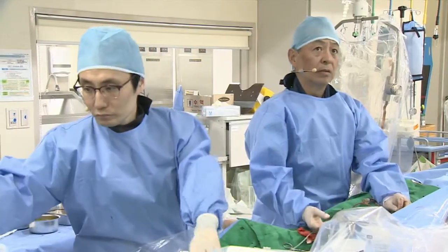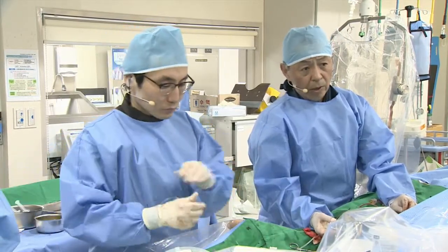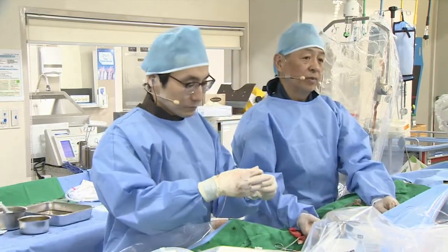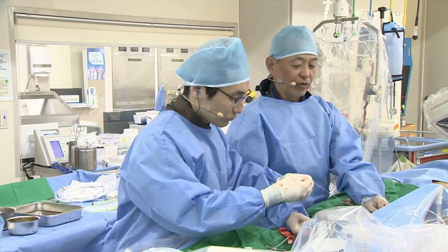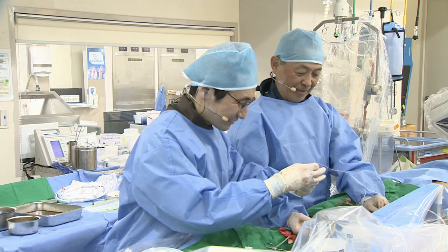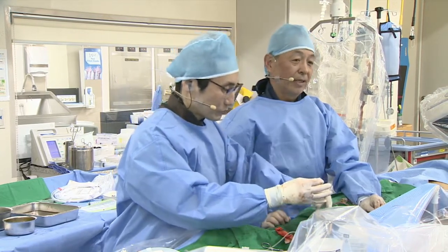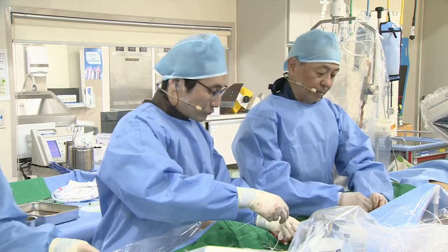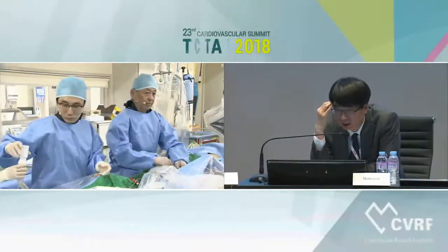Dr. Igarashi sensei, I'm Dr. Zhou. What do you think about intracoronary nitroglycerin injection? One option. But I want to finish as soon as possible. Another case lab is already nearly finished, so we wanted to see the final result and then come back shortly. Okay.